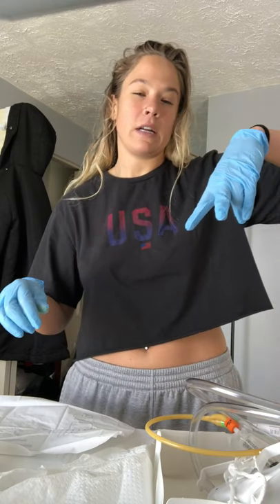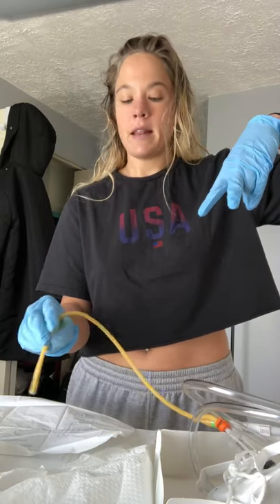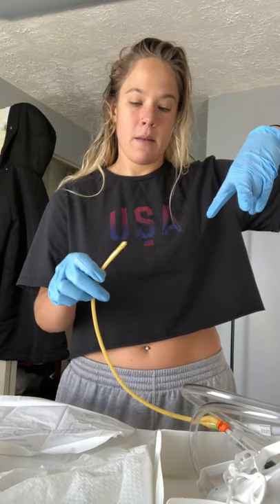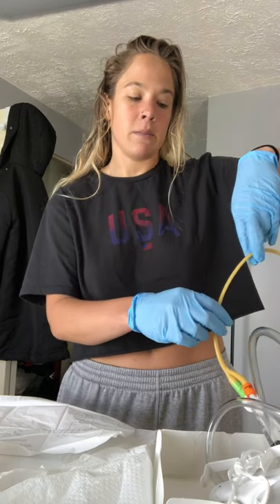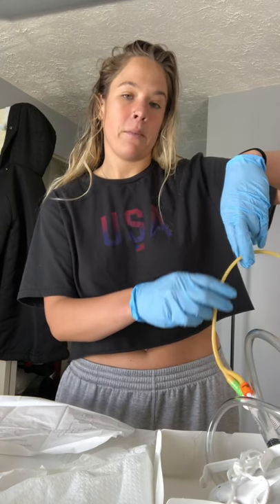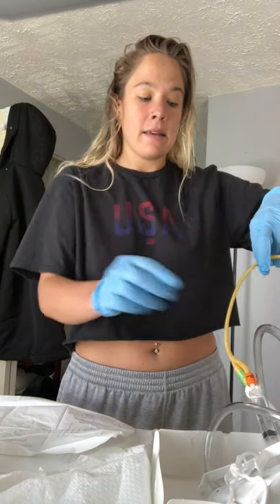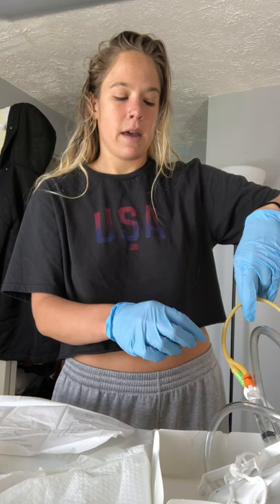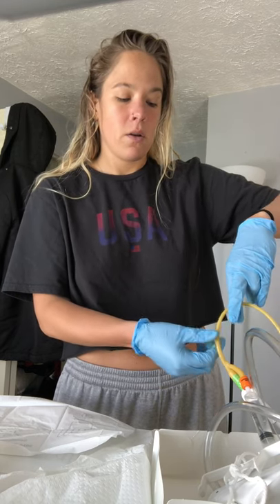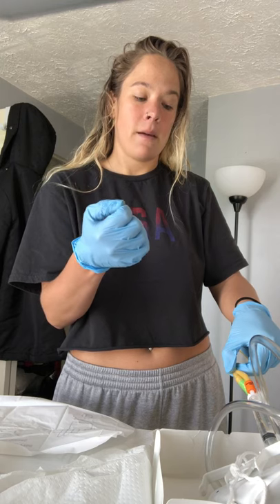At that point I'm going to still have my fingers on the labia spreading them. I'm going to let the patient know that she's going to feel some pressure. Then I'm going to lubricate the catheter and go ahead and insert the catheter until I see some urine flow back into the tubing. At that point I'm going to go one to two inches farther. Once that's in, I'm going to hold the catheter in place with my non-dominant hand.